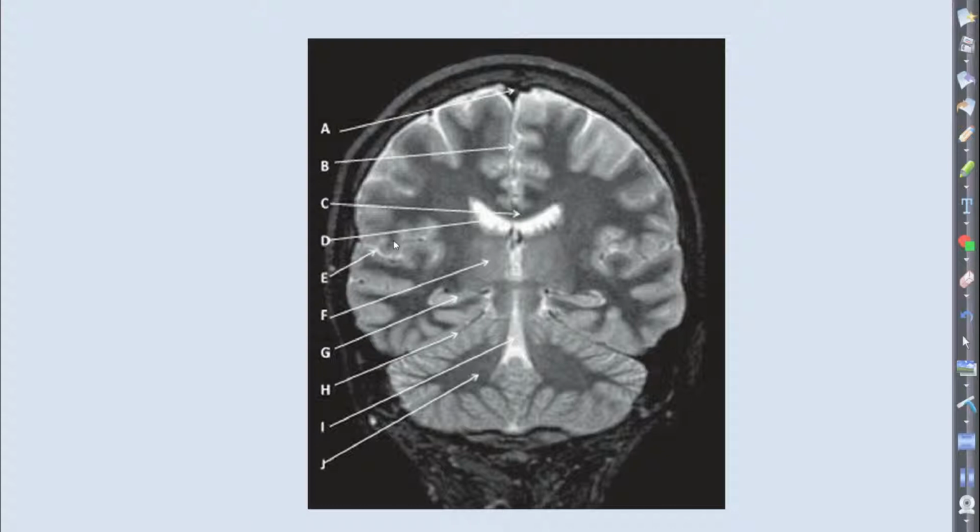D, that is our right anterior horn of the lateral ventricle. E, sylvian or lateral fissure, it's kind of the most pronounced fissure within the brain, divides what lobes of the brain? What's this lobe of the brain right here? Temporal. Temporal lobe. Then what do we have up here? Parietal. Very nice. All right, what is F?